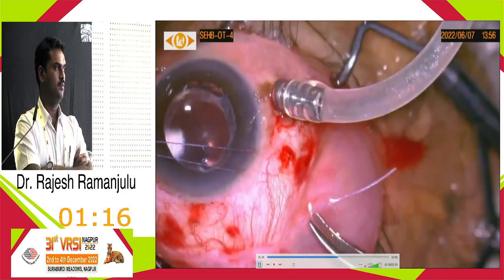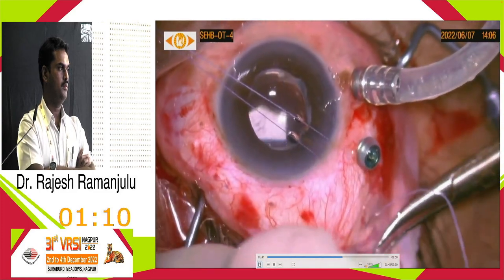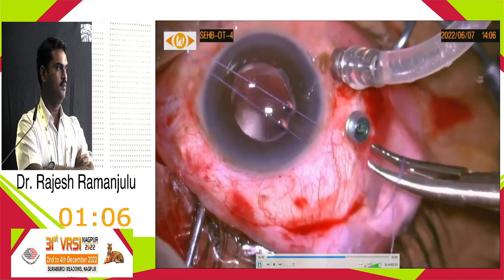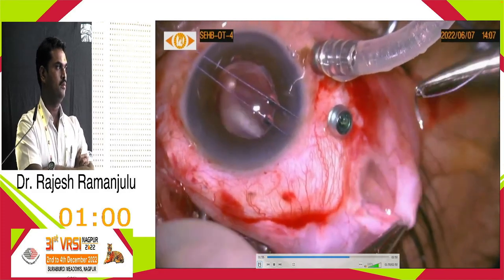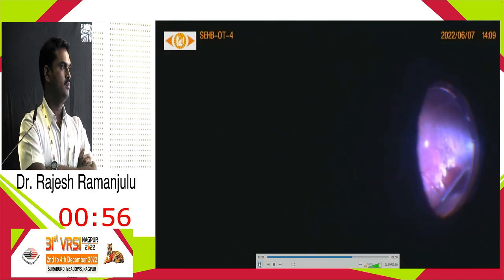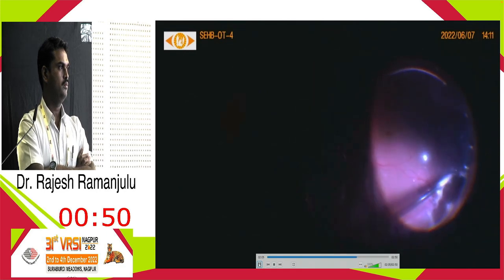We noticed a circumferential tear from 9 o'clock to 12 o'clock position. Attempt to suture it was in vain as we could not localize the posterior lip. Further rotation of the eyeball to the inferomedial quadrant increased the gaping, fish mouthing. As the inner opening into the suprachoroidal space was small, we decided to plug this with gelatin sponge.